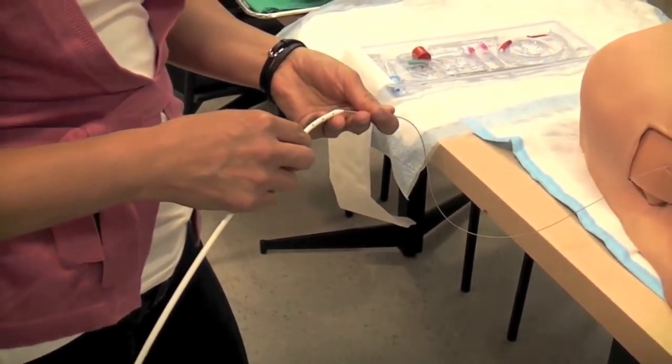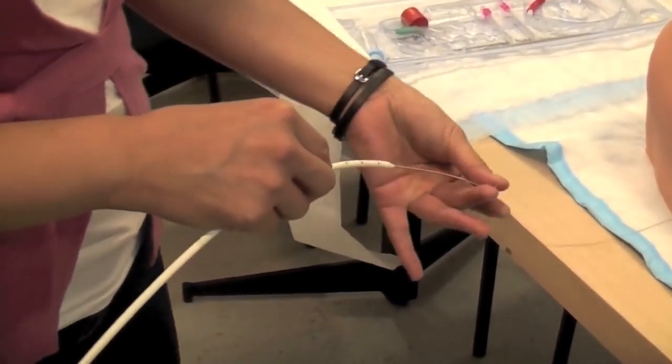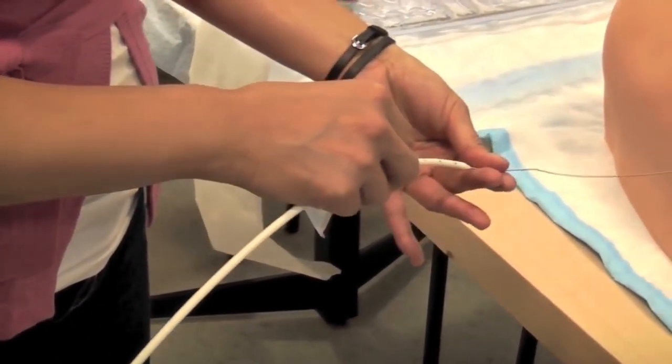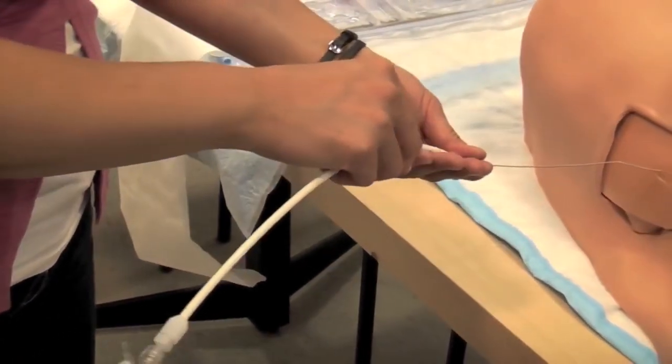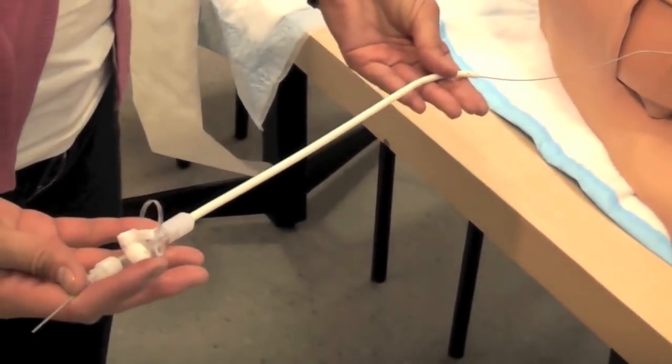The entire assembly is threaded over the guide wire. Ensure the guide wire end exits through the obturator.